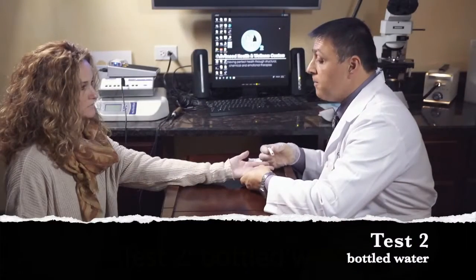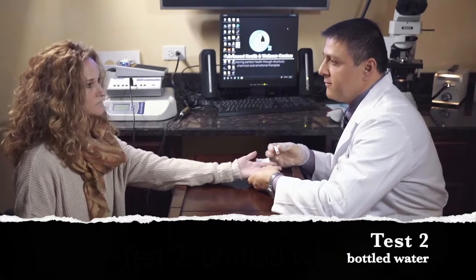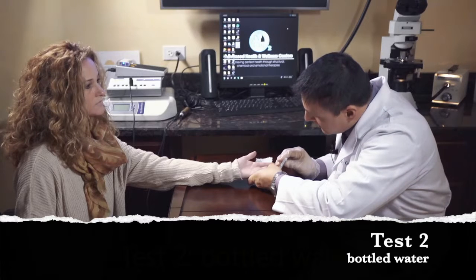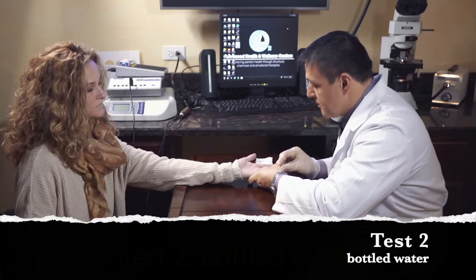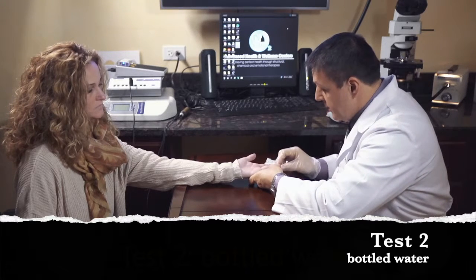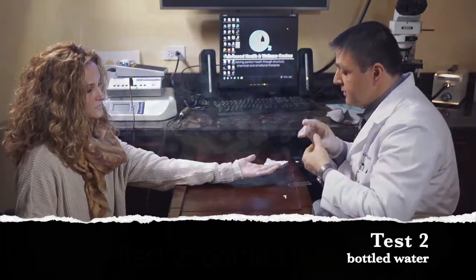Okay, now we're going to do the second test. You've drank that bottle of water. It's been roughly 5 minutes. Okay, so we're going to go through the same process. I'm going to get the same finger, a different spot. And we're going to look under the microscope and see if we have any changes.